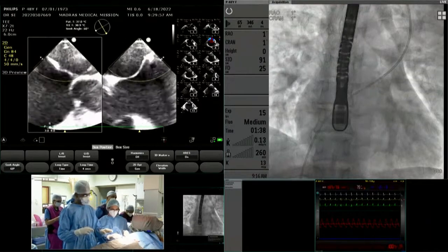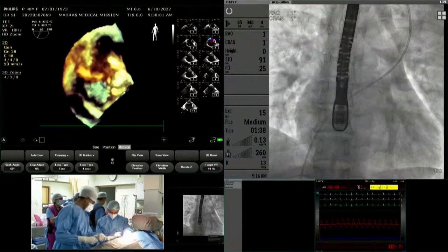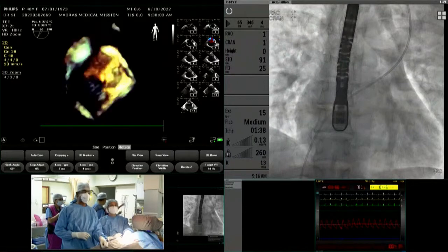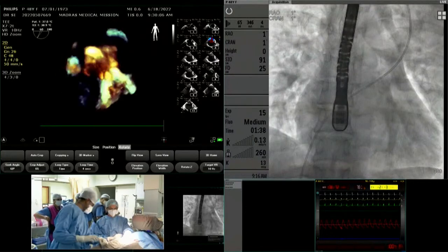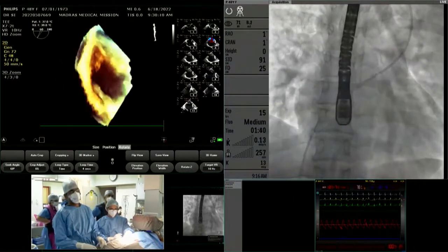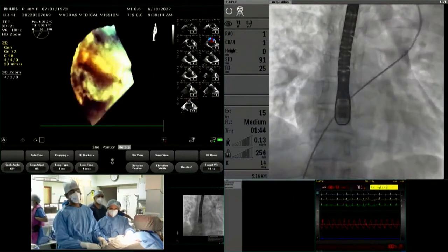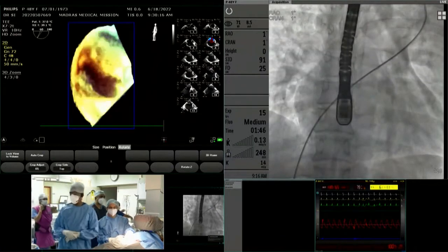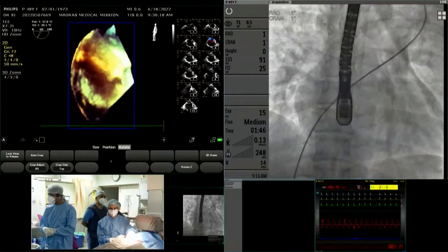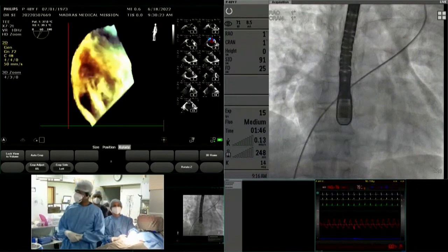As he was preparing, in the meantime, you can observe that I took my catheter into the superior vena cava, came down from the superior vena cava and walked into the first defect, and I have the wire catheter through the first defect. We are going to do a balloon interrogation using the LifeTech balloon. Show the LifeTech balloon.